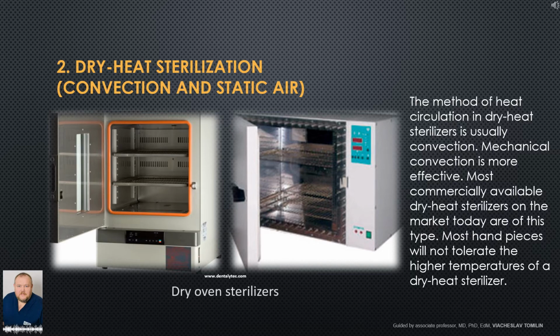The higher temperature of a dry heat sterilizer means that paper will scorch and plastic will melt. Specialized packaging material is available for dry heat sterilizers. Most handpieces will not tolerate the higher temperatures of a dry heat sterilizer. Mechanically driven handpieces that contain turbines and bearings are susceptible to damage at higher temperatures. The manufacturer's instructions should be checked for compatibility of instruments, devices, and materials with the unit, and the handpiece manufacturer's instructions should be followed for preparation of the handpiece prior to sterilization and for sterilization itself.